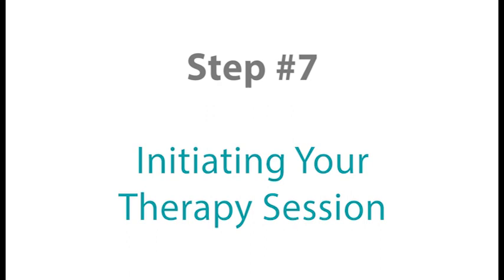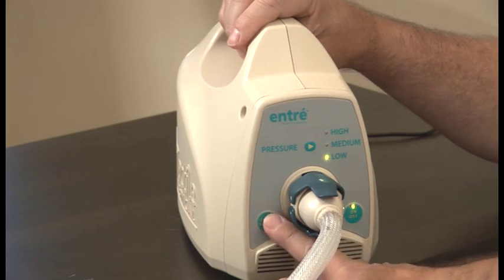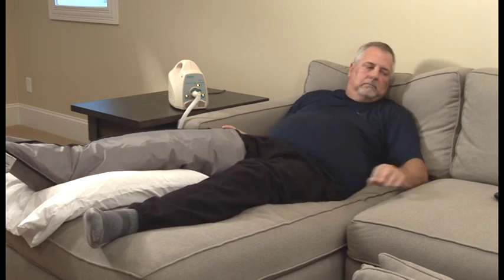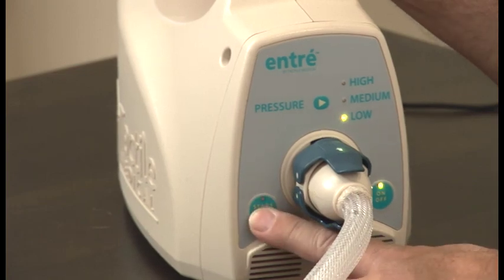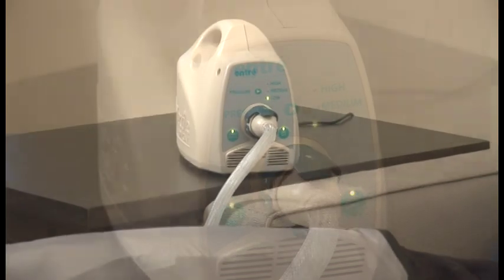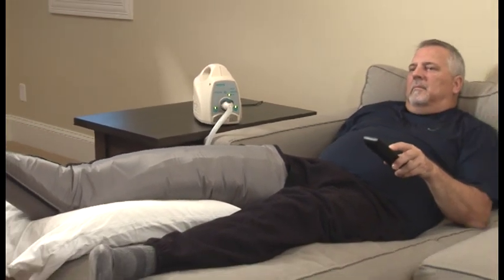Step number seven. To start your therapy session, press the Start/Pause button located on the front panel of your control unit. A green light will illuminate the Start/Pause button and you will hear the controller compressor starting to fill the garment. If you need to pause your therapy session for any reason, press the Start/Pause button. The controller will remain paused for up to 15 minutes. To resume your therapy, press the Start/Pause button once again. If the controller is paused for more than 15 minutes, it will turn off, requiring you to restart your therapy session. The system will automatically stop after 60 minutes once started.